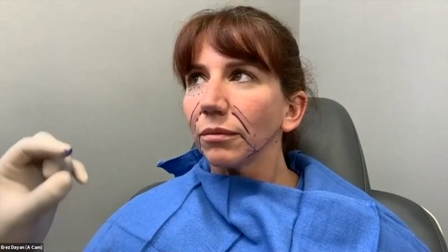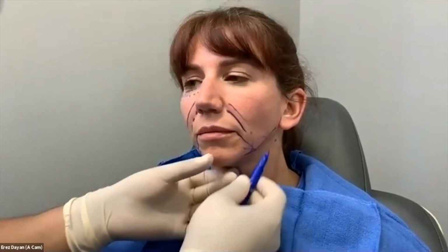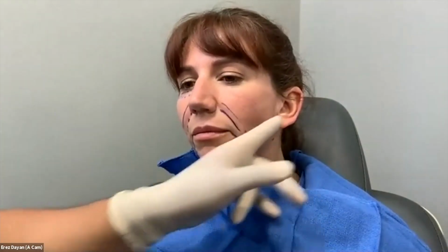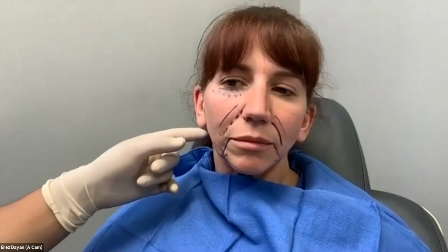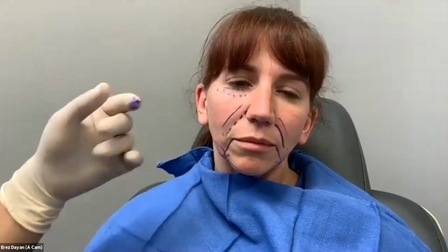And I like doing that with AccuTight because it's a small access point. It's just a needle stick. I'm not putting an incision on the central face. So I can treat this whole area with the AccuTight from a medial to lateral approach. Now, if I wanted to, I could just as easily come in through here and do face tight across the whole lower face and neck. Same thing.